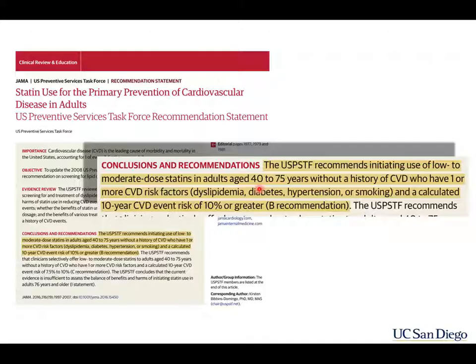So that's HeartFlow in a nutshell, and it is a very new technology that has had FDA approval for about 3 years, something like that, and they recently got reimbursement approval from CMS, and in the United States, this is amazing.